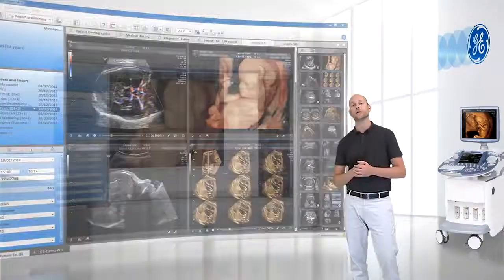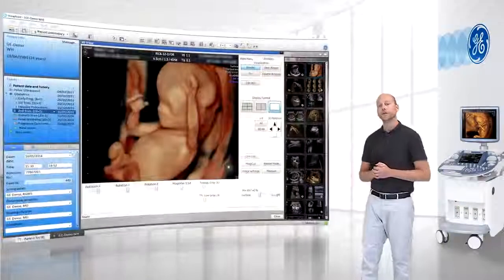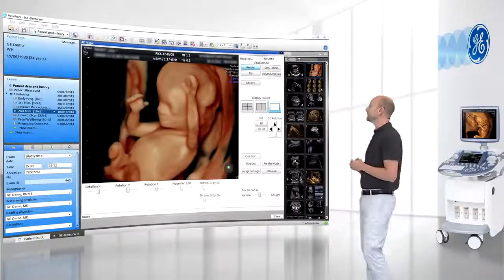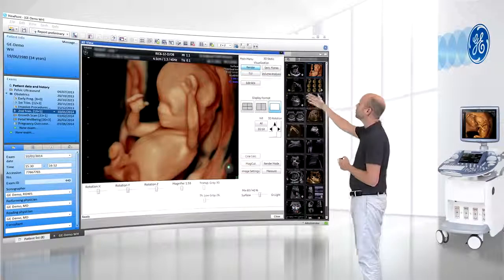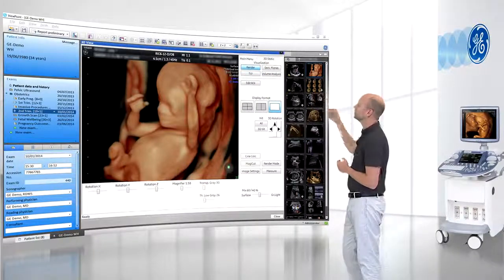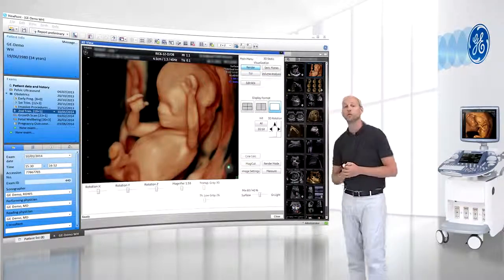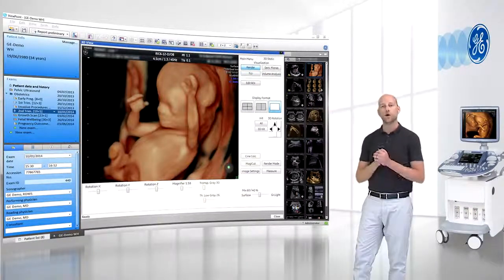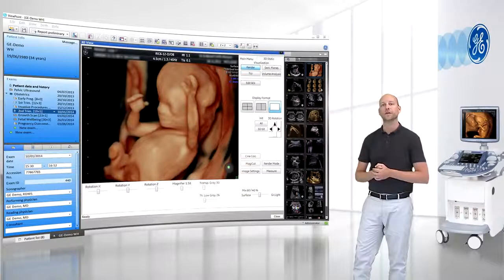And in addition, the integrated 4D View application brings the Voluson technology directly to your Viewpoint workstation, giving you all the tools that you are already familiar with.